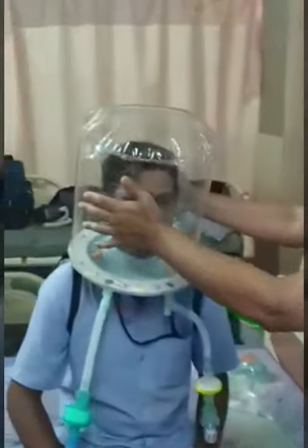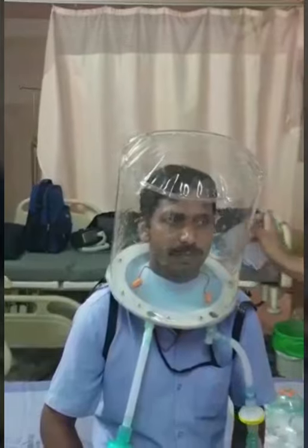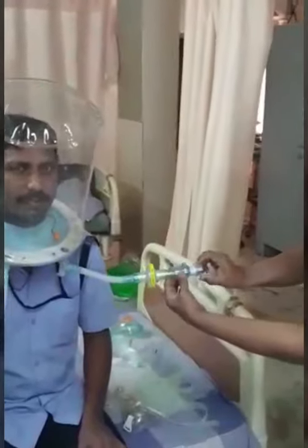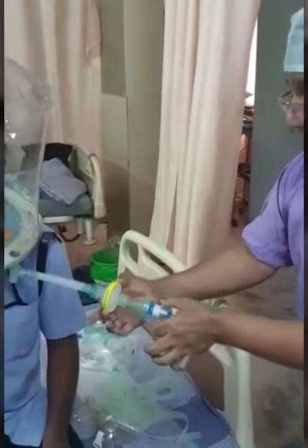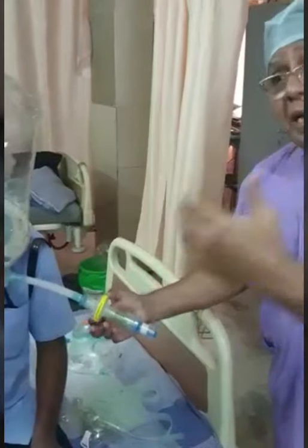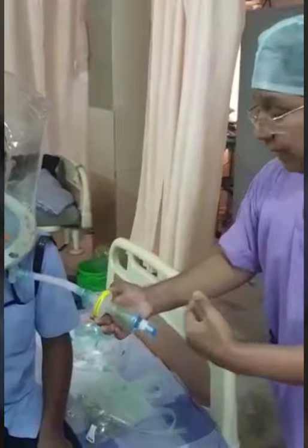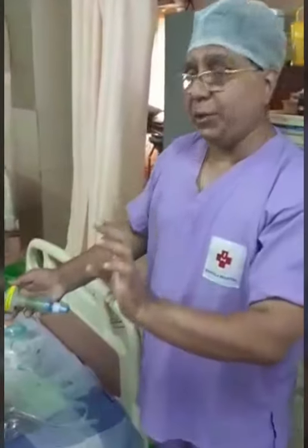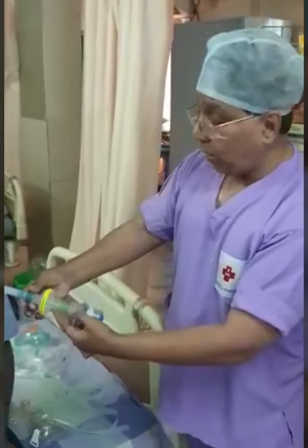This is transparent and patients do not feel claustrophobic with it. Here again, I am showing the mechanical PEEP valve and how to adjust it. This virus filter that we attach here takes care of the virus coming out from the patient during the process of expiration, so that the contamination and viral load in the ICU is reduced drastically, and the staff are not exposed to high viral load.